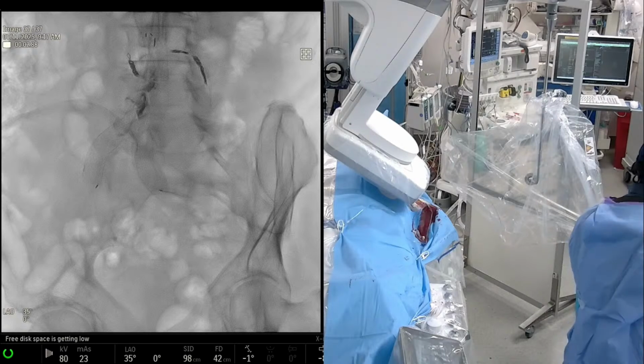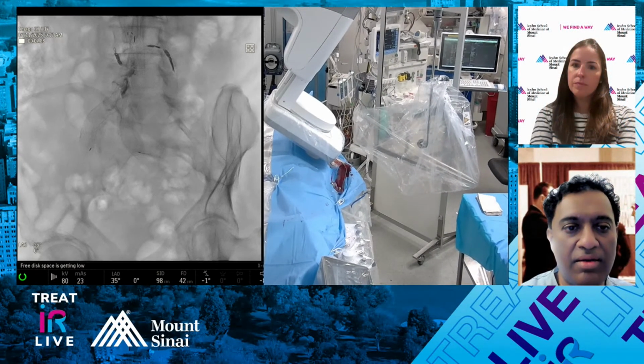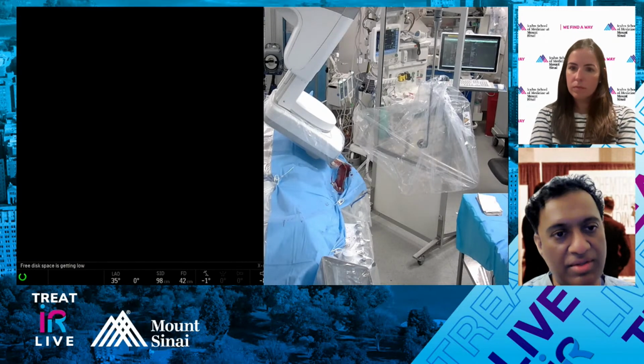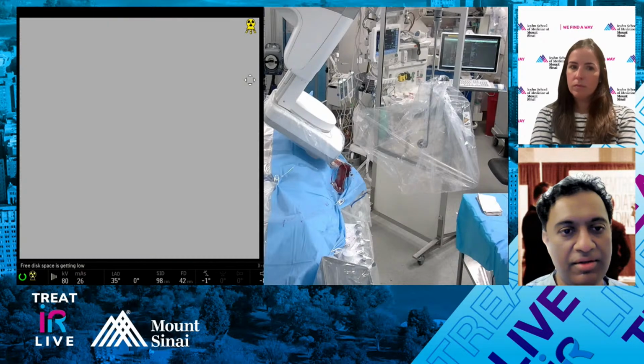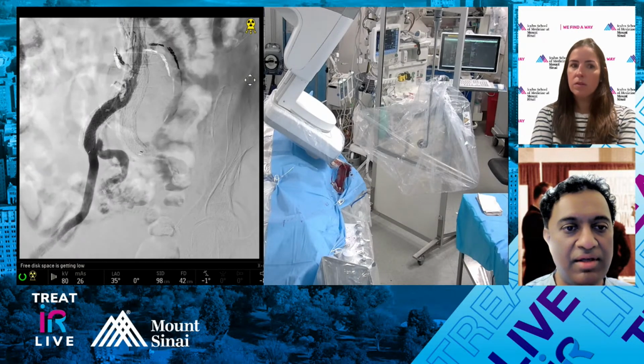Sometimes what I'll do to work these up is get an MRA with subsecond coronal imaging, like TWIST or TRICKS. That way sometimes you see the angiographic flow pattern. Or contrast-enhanced ultrasound, which I've started to use a little bit for these kinds of occult leaks.